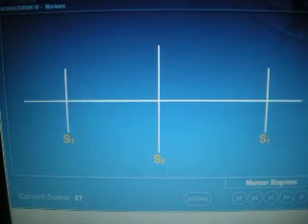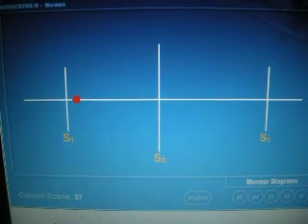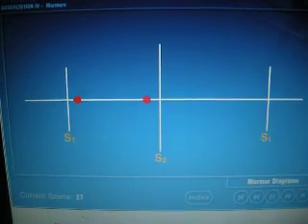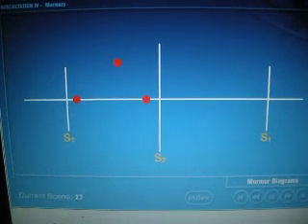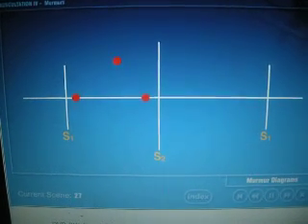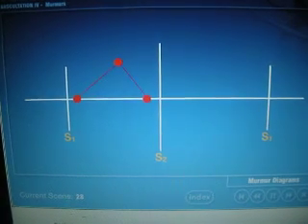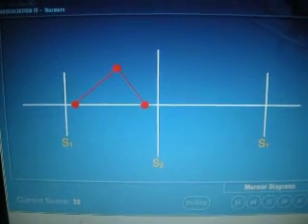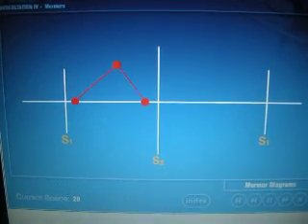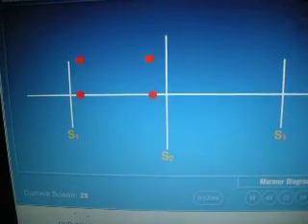After heart sounds have been drawn, place a dot on the timeline at the beginning of the murmur. Place another at the point it disappears. Place a third dot at the loudest point, whose level above the baseline is proportional to loudness of the murmur. In many murmurs, joining these dots with a line will provide a profile, but after sharp rises and falls, some murmurs have relatively constant amplitude, and you will have to add a second amplitude dot before joining the dots.